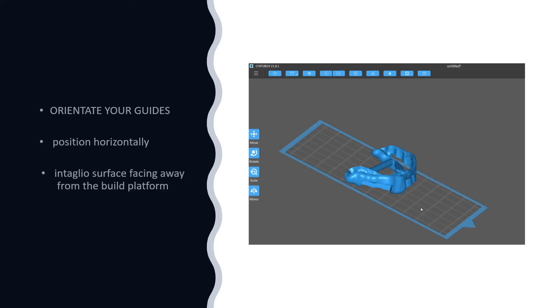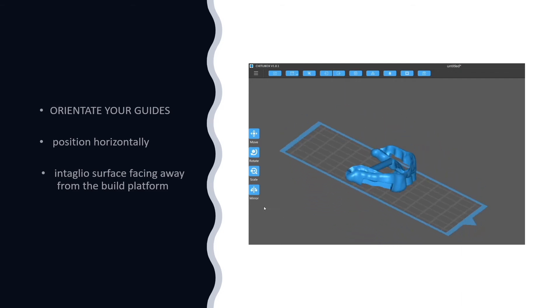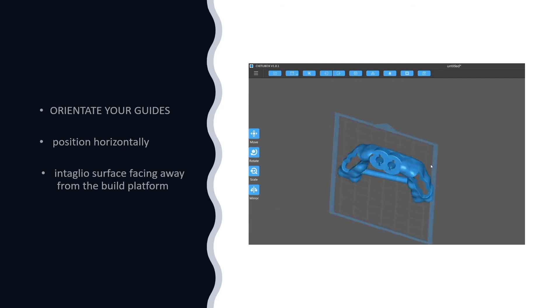Regardless of what nesting software we use, there are some common considerations we should take into account to ensure a successful print regardless of which printer we're using. It's important to orientate your guide in a horizontal position, but also ensure that the intaglio surface faces away from the build platform in order to keep supports away from the fit surface.